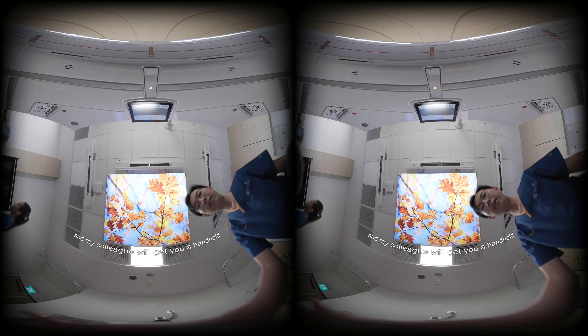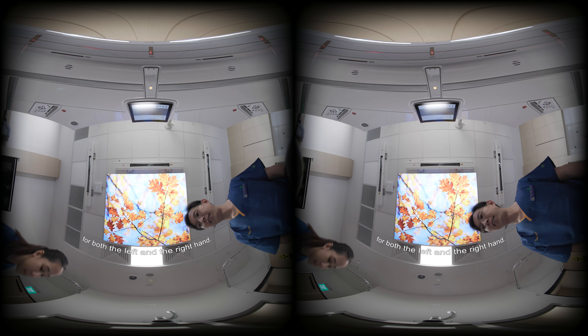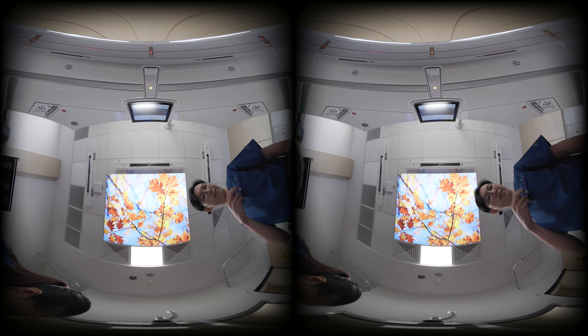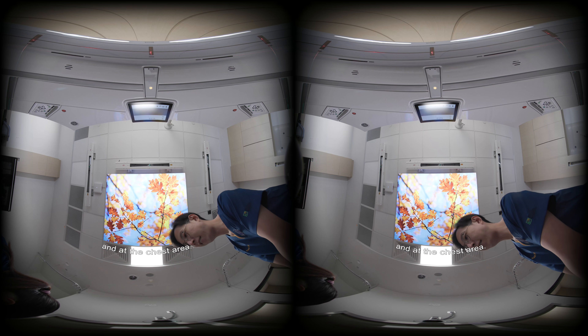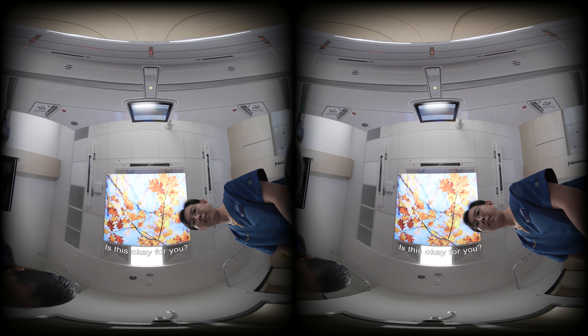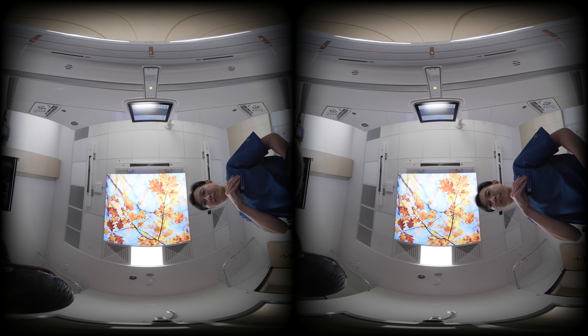My colleague will get you a handhold for both the left and the right hand. In the meantime, I'll draw some markings on your skin at the neck and at the chest area. Is this okay for you? Yeah. Very good.